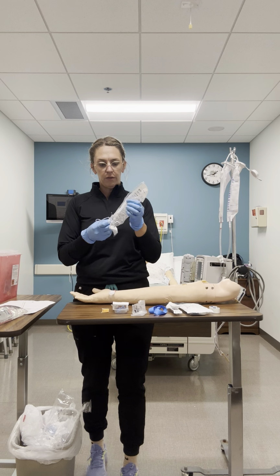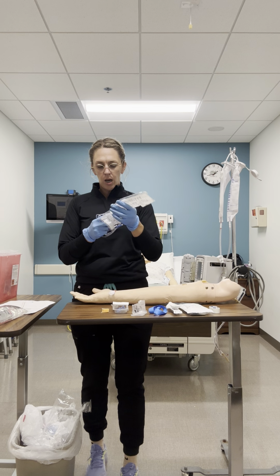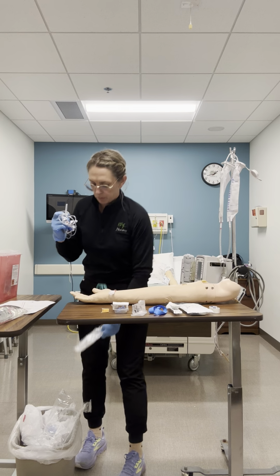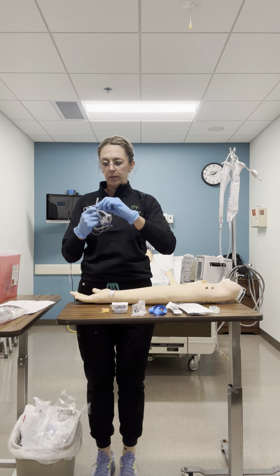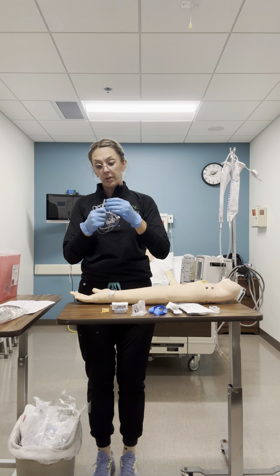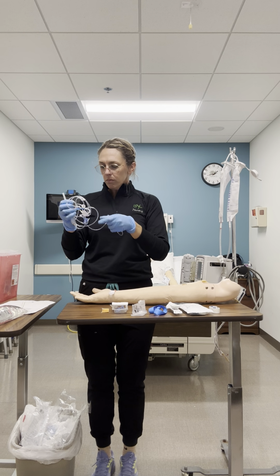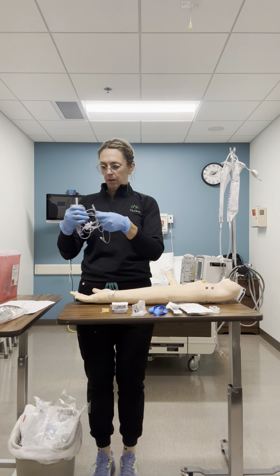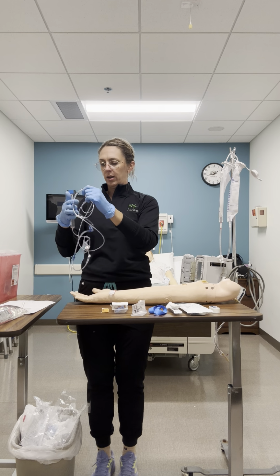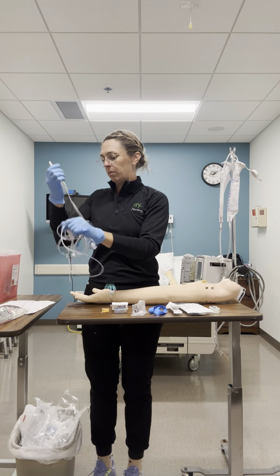We ran out of unopened sets for this video, so I'm going to use an open set. I do have my lids, but all of this would be aseptic, and this would be clearly unopened if this was a real patient. That was not an option for me today. So I have my tubing. I'm looking at all of my tubing and it looks good. I'm going to go ahead and prime my tubing.